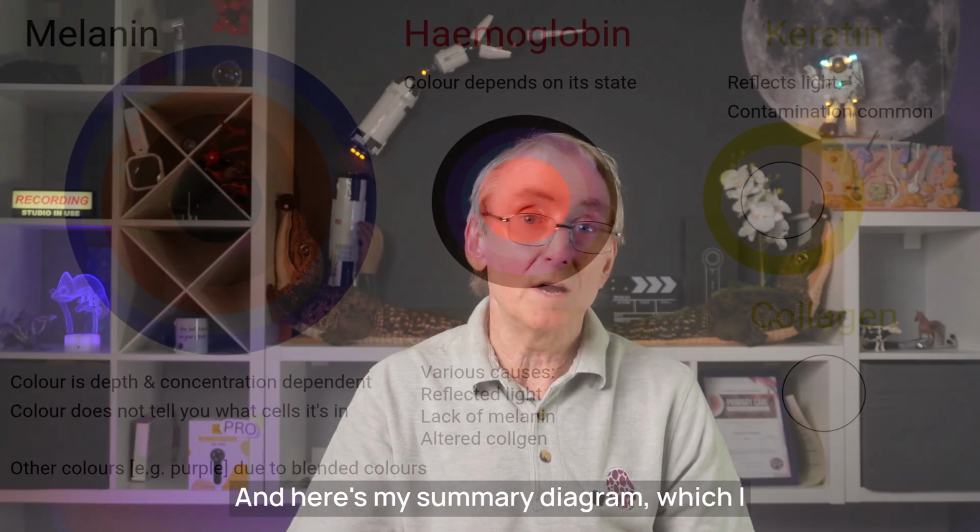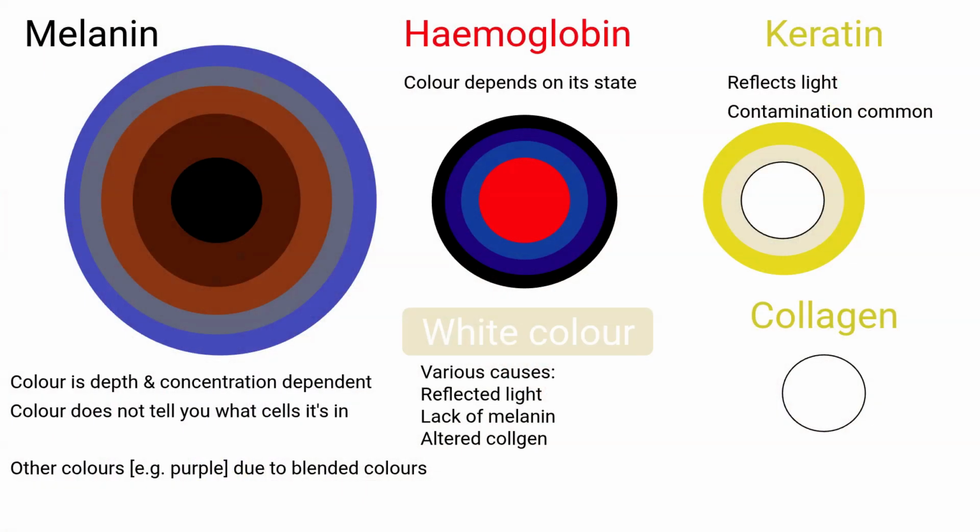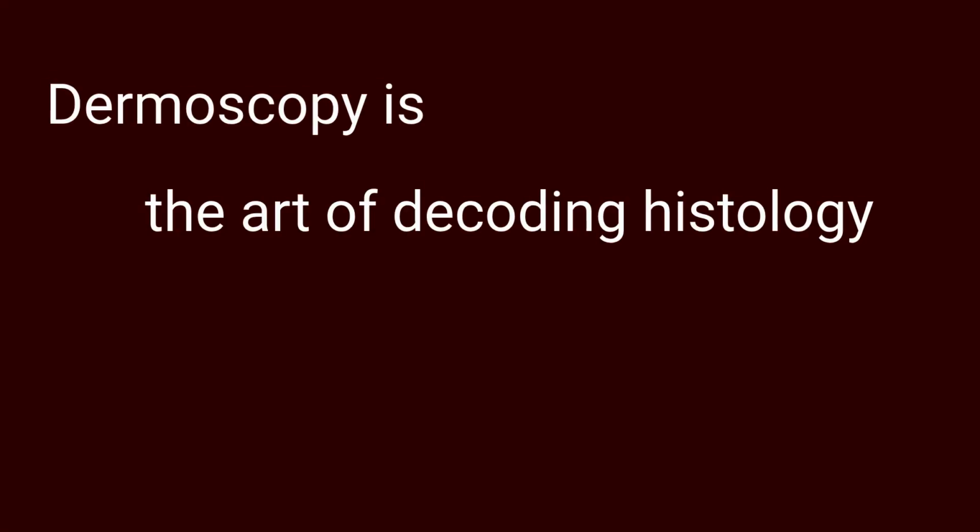And here's my summary diagram, which I hope you find helpful. You can download it from the video description below. And remember, dermoscopy is the art of decoding histology without resorting to a knife.